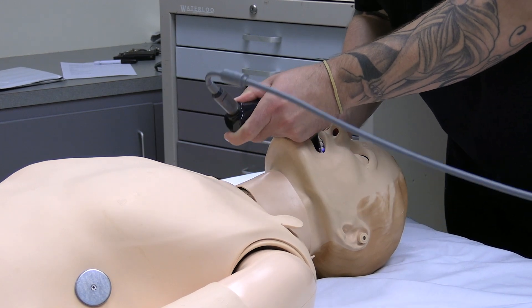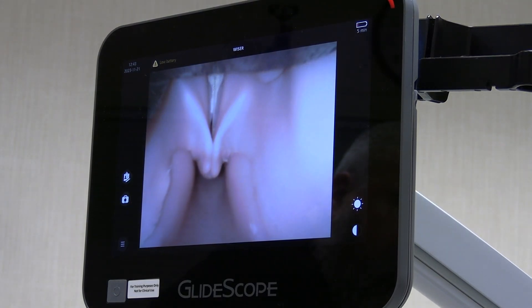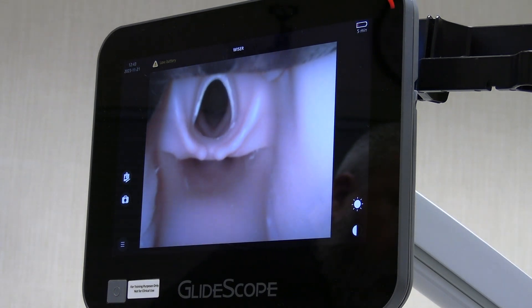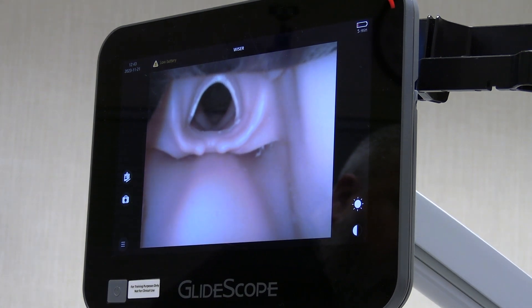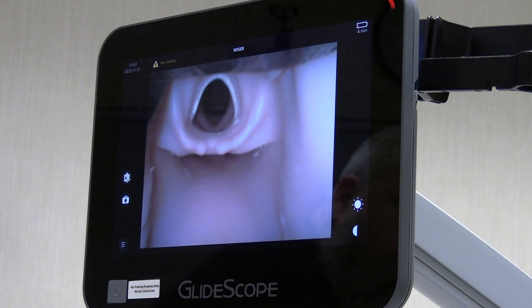SimMan 3G has many airway features helping to simulate different difficult airways. Features include tongue swelling, trismus, pharyngeal obstruction, and laryngospasm. You can also simulate a foreign object in the airway and create a decreased cervical range of motion.